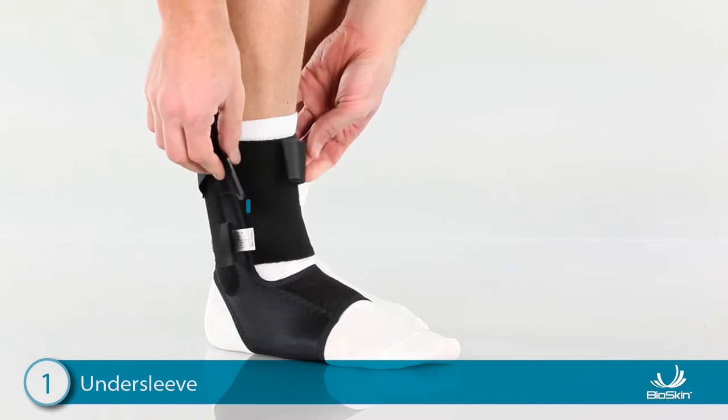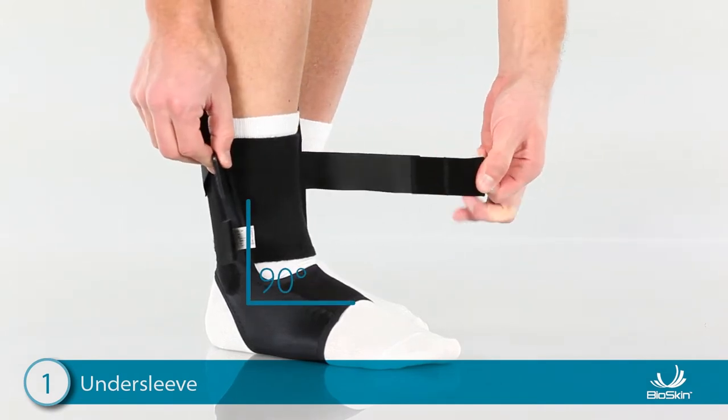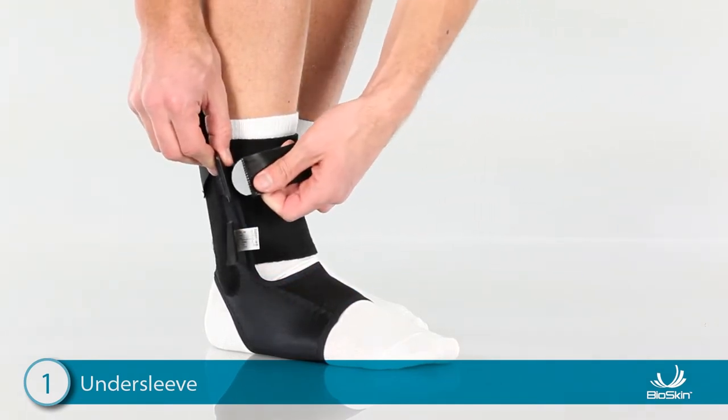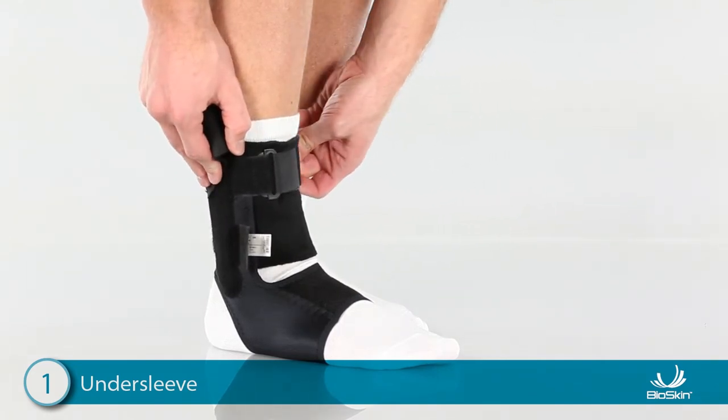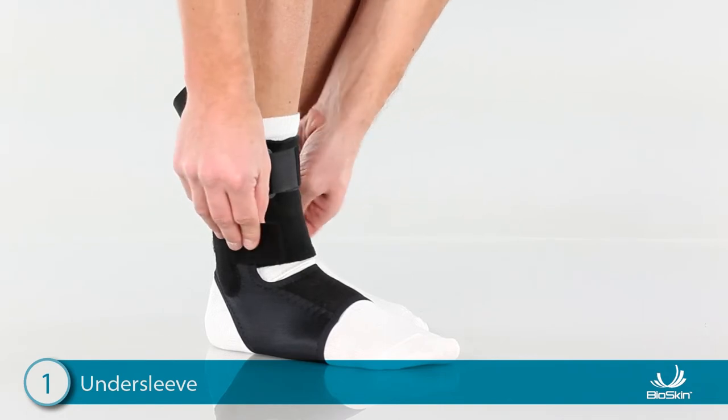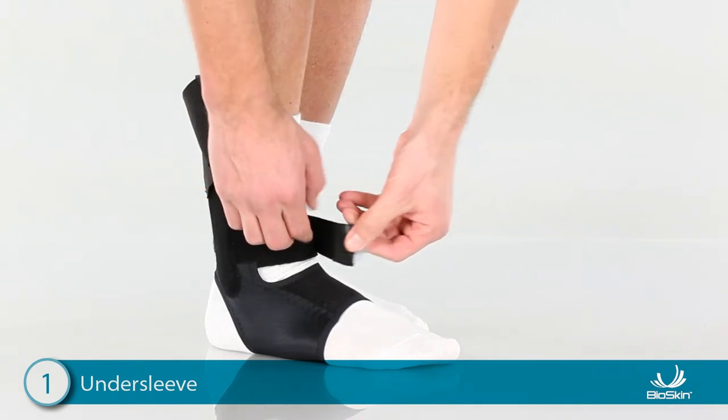To close the undersleeve, position the foot at a 90-degree angle. Then pull the top strap through the D-ring, cinch snug, and attach. It is important that this strap is comfortably tight. Then pull the lower strap around the ankle and attach.